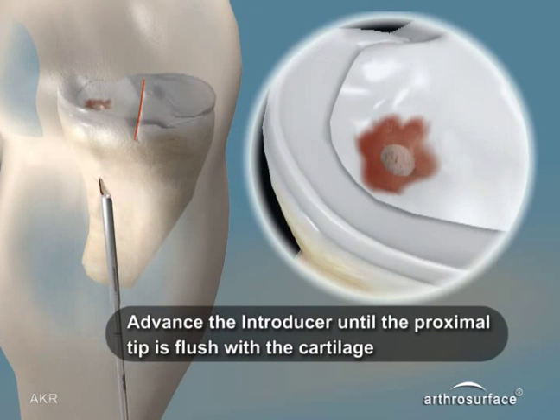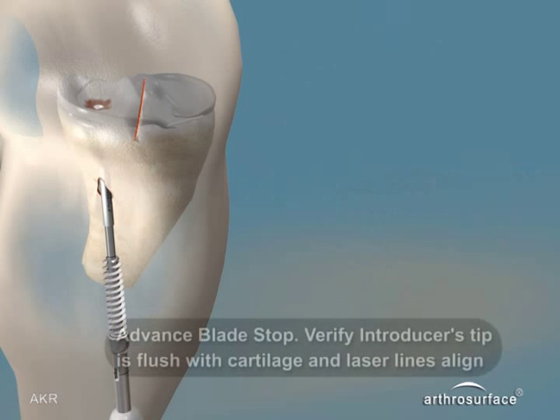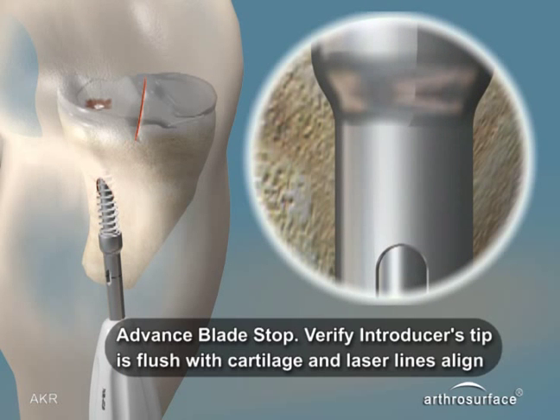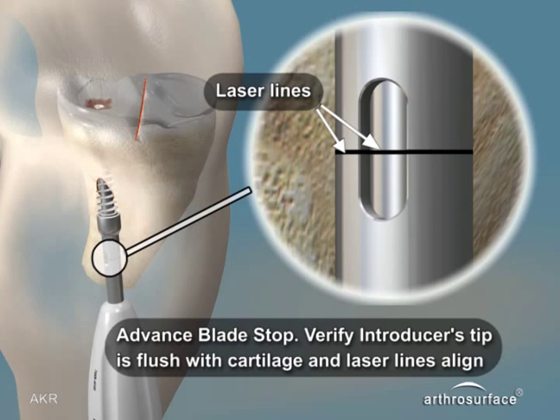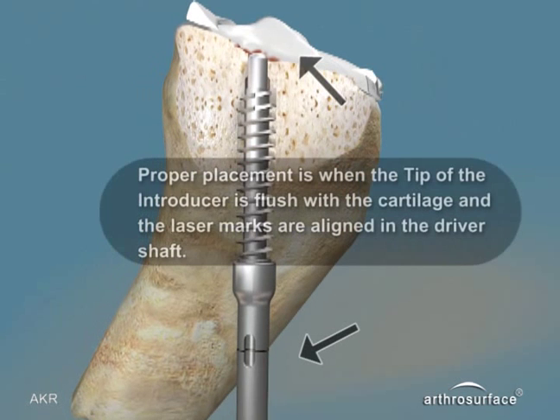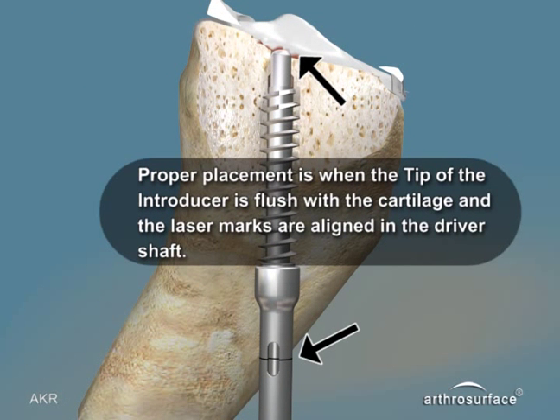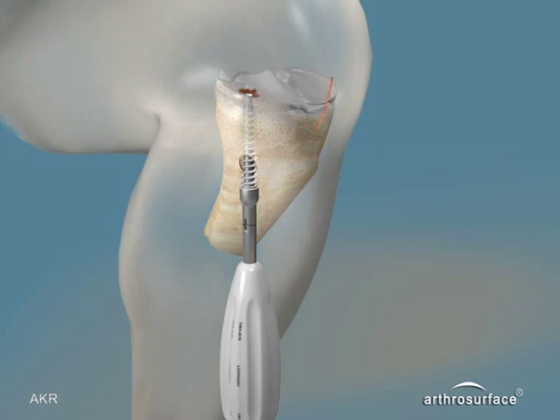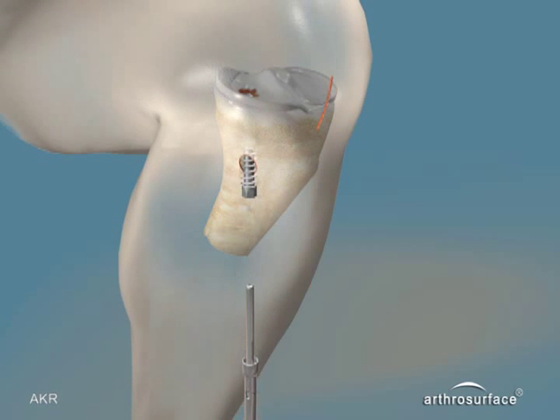Advance the introducer until the proximal tip is flush with the cartilage. Insert the threaded blade stop, which will become the depth stop for the tibial cutter so that we can create the optimal socket depth for the implant. The blade stop is inserted over the introducer until the laser marks on the driver handle are aligned with the laser mark on the introducer shaft. Proper placement is when the tip of the introducer is flush with the cartilage on the plateau and the laser marks are aligned. Remove the driver and the introducer, leaving the blade stop in place.